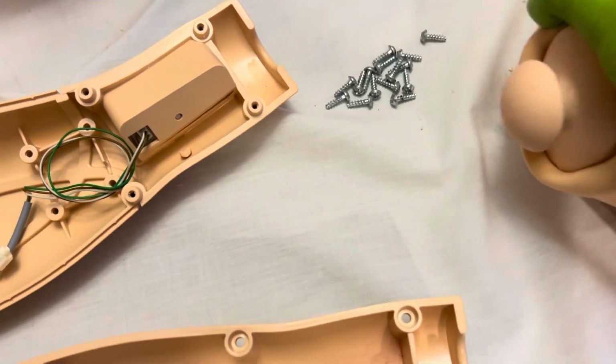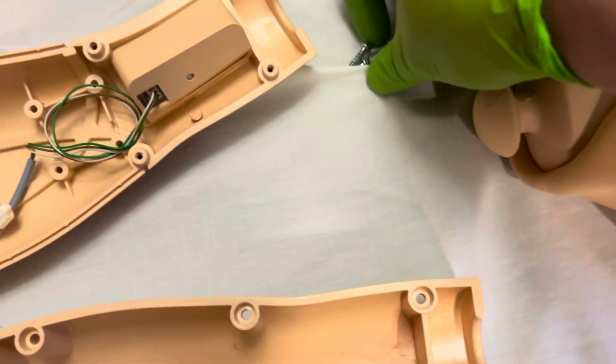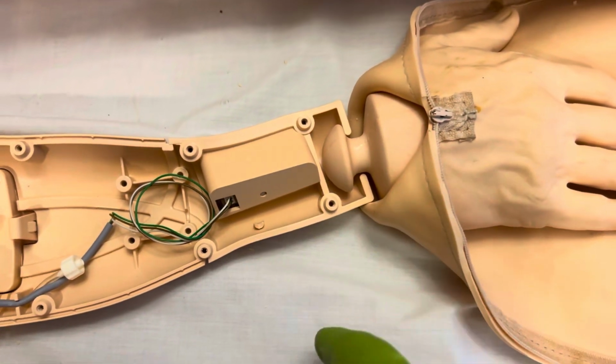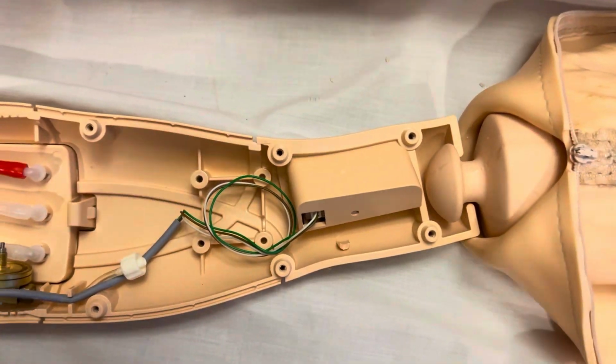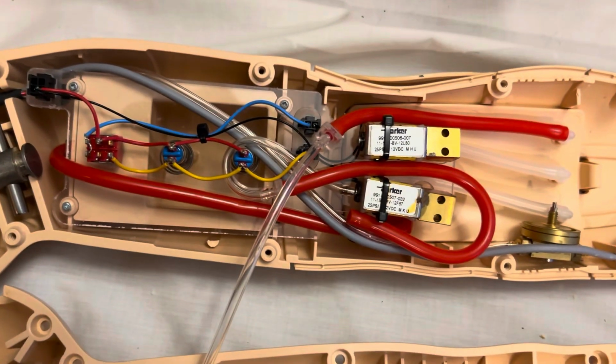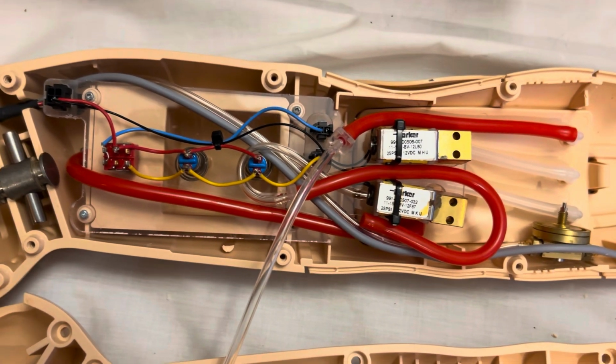So I like to roll the hand skin up all the way forward if I can, and then that way, when I'm putting it into the contact point there, whatever it's called, I don't care, it will seat in there quite nicely, and it won't be so hard to put the casing back together.